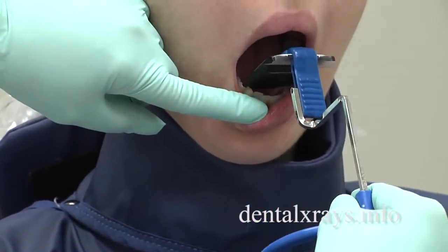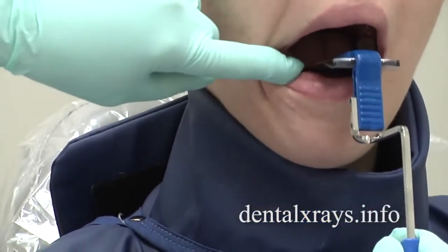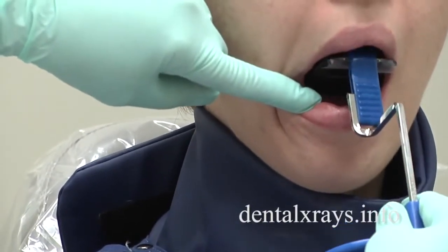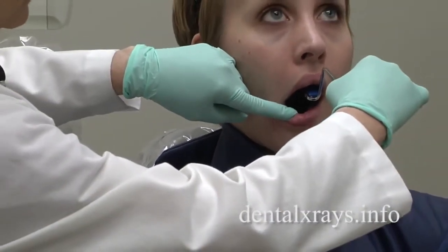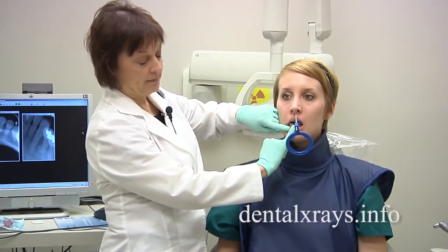If you notice, I'm not directly behind the teeth — I've got the film way back by the molars. Before she closes, what I'm going to do is roll the whole unit upward and then have her gently close and bite. Your goal is to get the lower teeth right up onto the bite block.